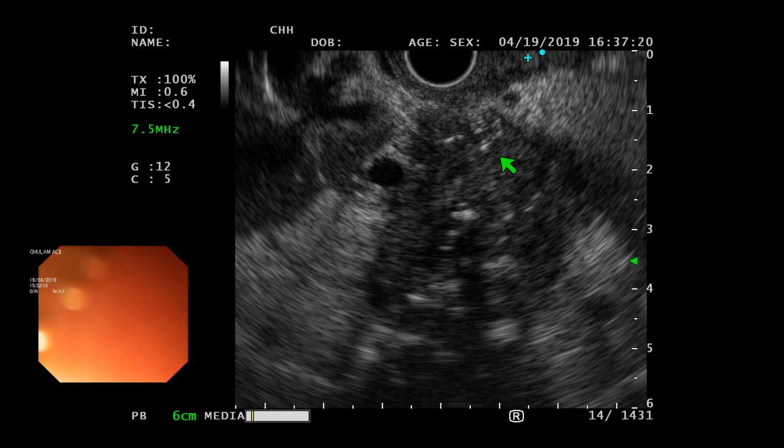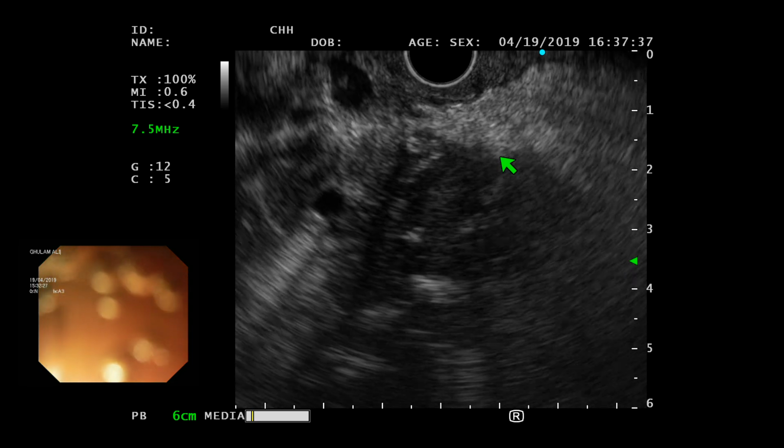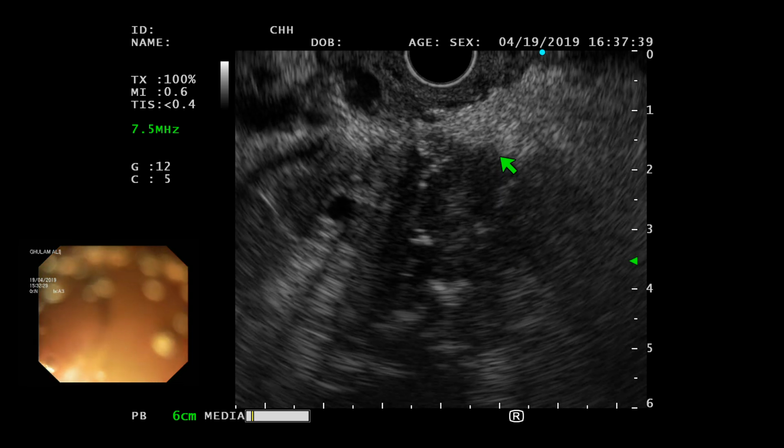So this is a little tangential image. This is muscularis. You see it's kind of swollen. So I think I'm going to pick somewhere in the middle, and it's probably up to here. It's 7 millimeter here, and I'm compressing that. And duodenal wall, normal, how much should that be? 4.